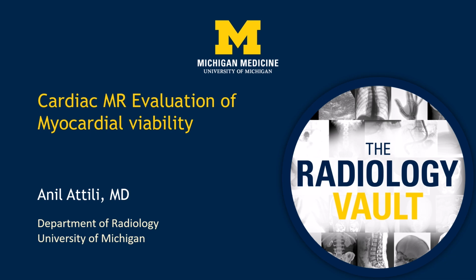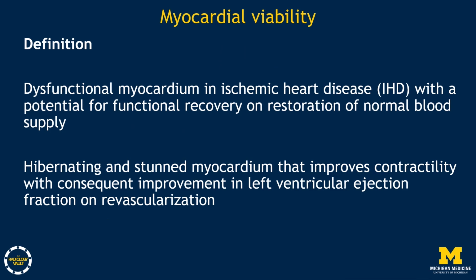Hello, my name is Anil Attili, and this talk is on cardiac MR evaluation of myocardial viability. We shall be using the acronym CMR for cardiac MRI. Let's start with the definition of myocardial viability.